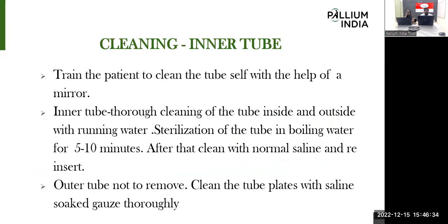Then proper cleaning in between, mainly of the inner tube, is mandatory in tracheostomy, so that we can maintain a proper airway for the patient. The outer tube stays in place, as the sister said; only the inner tube is removed in between for cleaning. We need to train the patient to use a mirror to see their own tracheostomy area.